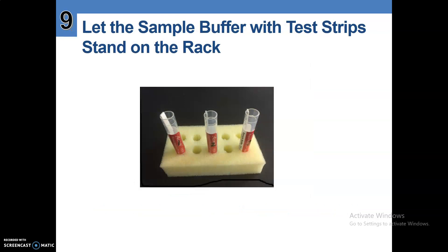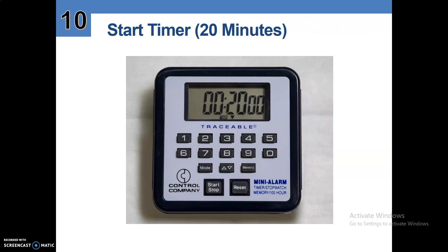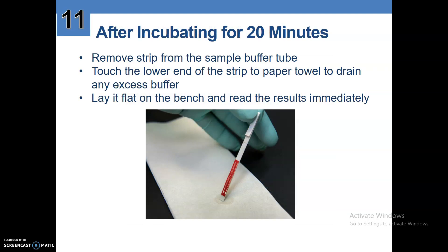Number nine, let the sample buffer with test strip stand on the rack for 20 minutes. Start your timer immediately. After incubating for 20 minutes, remove the strip from the sample buffer tube. Touch the lower end of the strip to a paper towel to drain any excess buffer. Lay it flat on the bench and read the results immediately.